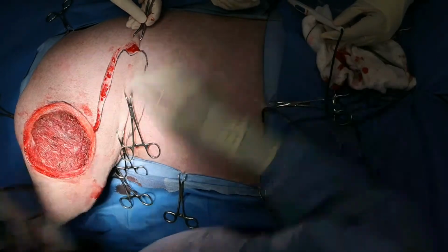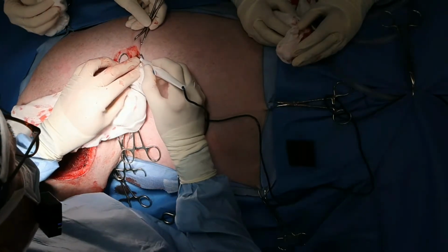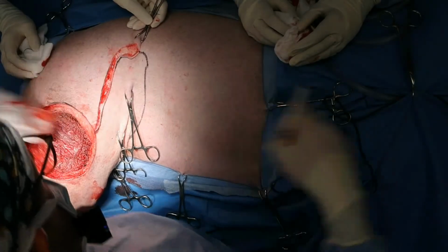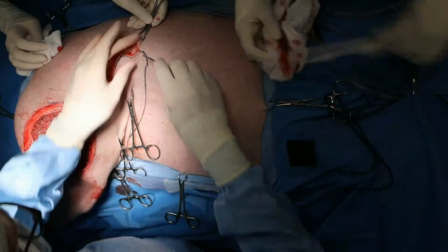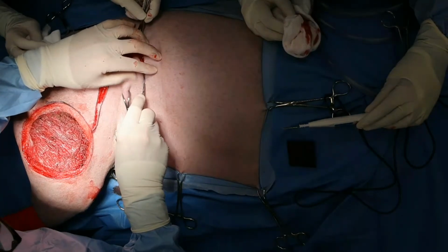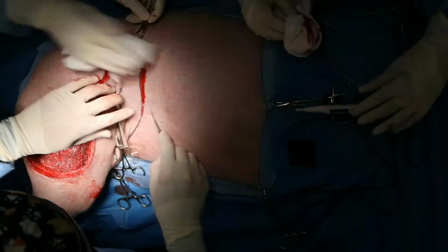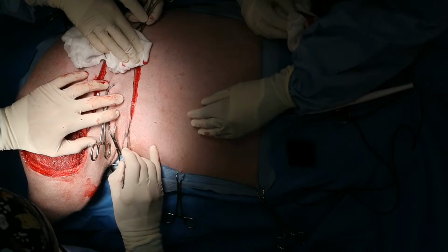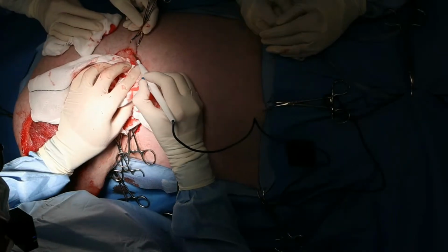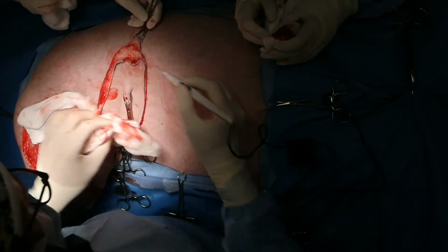That's deep circumflex iliac right there. That's that ventral branch. Yeah, so that vessel that's bleeding a bunch right there is deep circumflex iliac ventral branch.